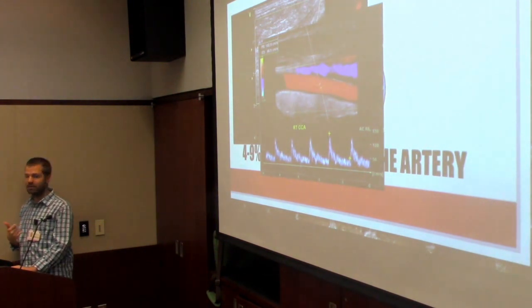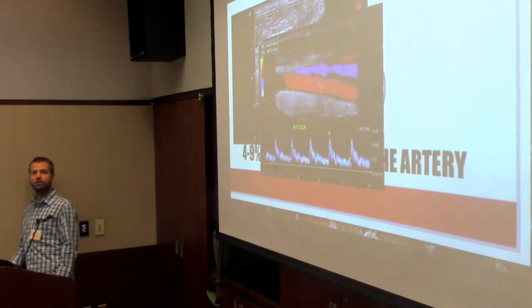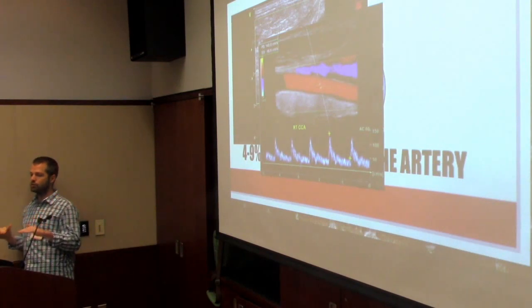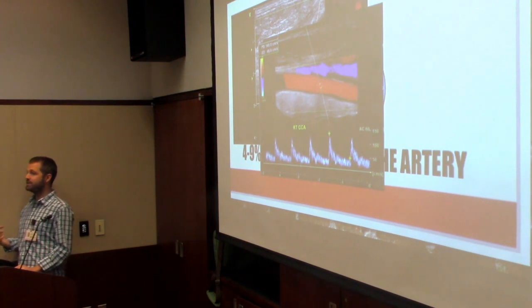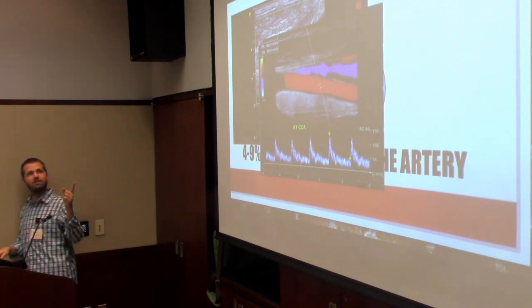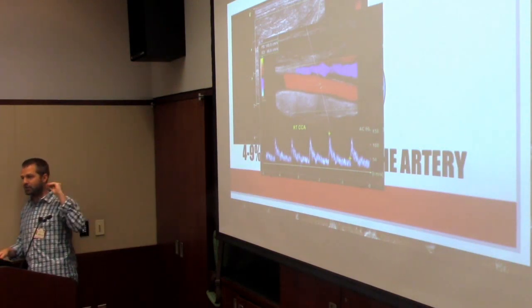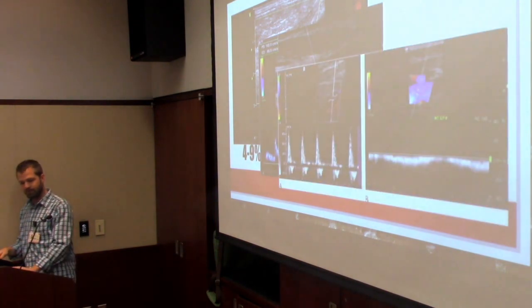So ultrasound machines have the ability to put down Doppler. And I don't just do the waveform. So this tells me it's an arterial waveform because you see a huge spike in velocity and then it kind of calms down. If I'm not sure, or if I'm teaching somebody, I'll put the audio on and listen. It sounds like a giant gushing artery. Swish, swish, swish. Helpful. Watching the pulsations, you see the waveform, you listen, and you actually see the color flash on, flash off. It's pretty convincing that it's an artery.